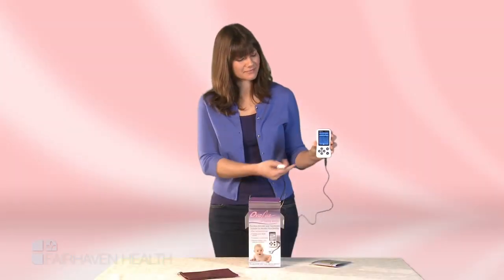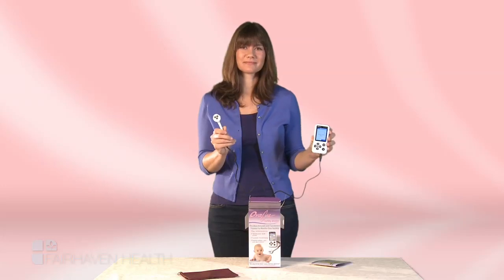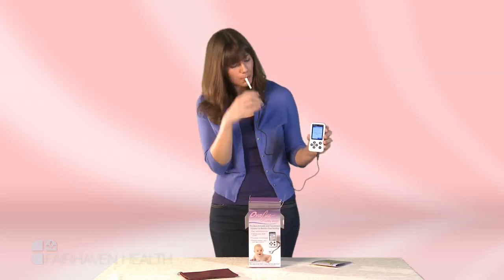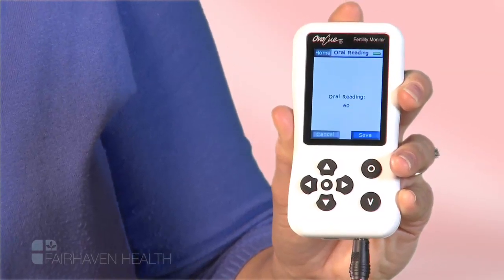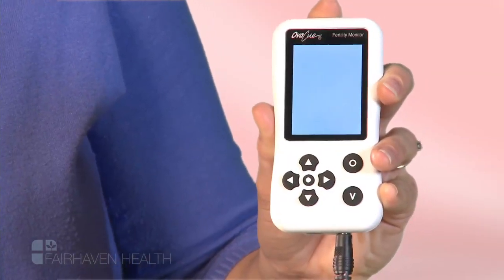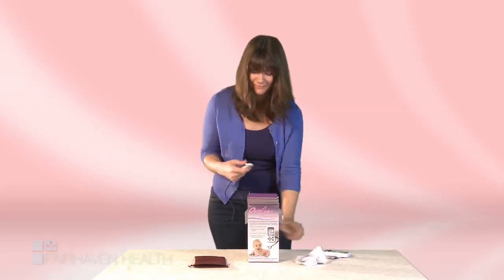To take your oral reading, simply press the O button located on the right side of the monitor. Place the spoon-shaped sensor with the three metallic circles face down against your tongue. Press the enter button and it will take your reading. Be sure to press the enter button to save your reading. Your daily reading has now been entered. Simply clean the sensor with mild soap and water and you're ready for your next day's reading.